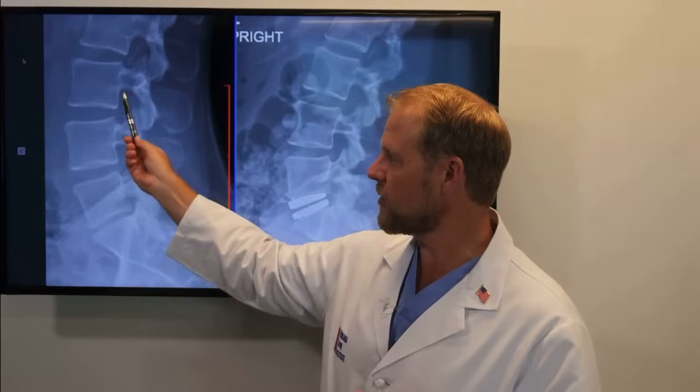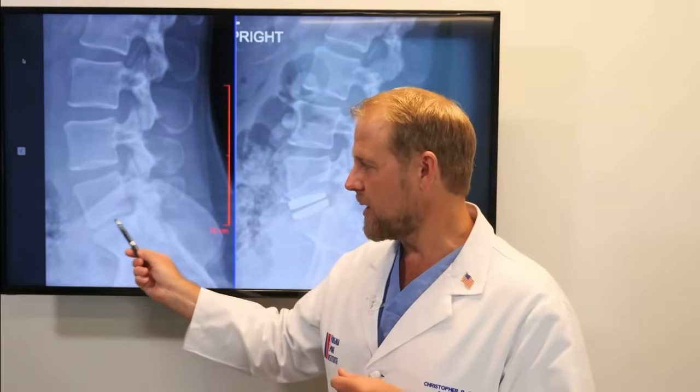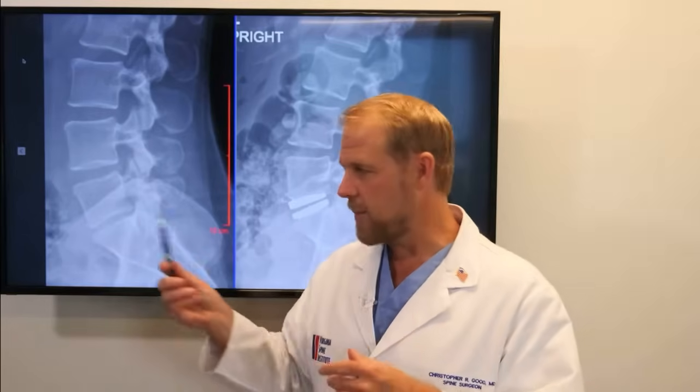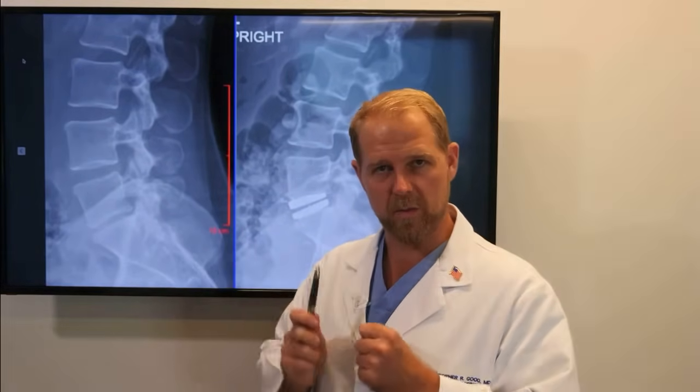We can see this circle here — it's narrowing that space, causing the patient to have pinched nerve symptoms or sciatica, nerve pain running down the leg. So our goal is to go in and fix both the back pain coming from the disc issue and the nerve problem coming from the pinched nerve.